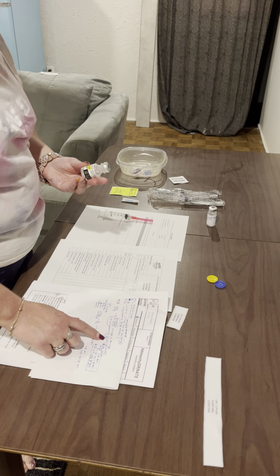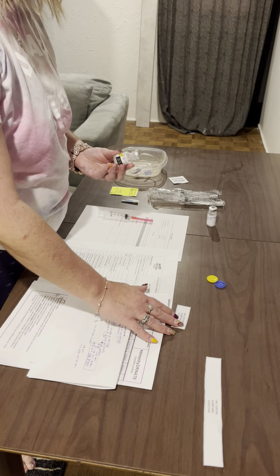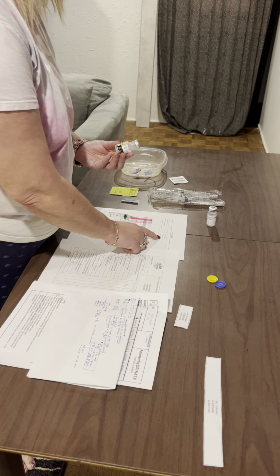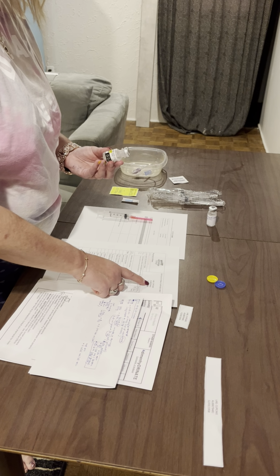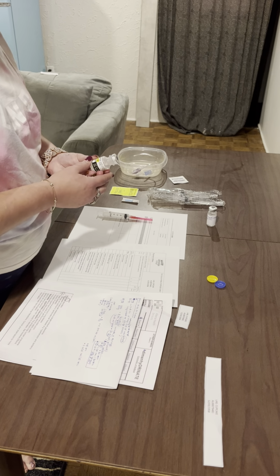Okay, so the next thing that we are going to do is draw up 4.5 mils of the normal saline. So let's double check it again. This is the normal saline, 4.5 mils. Cupcake Labs, December 3rd, 1958, 79481. And our med math as well. Okay, and this is normal saline.